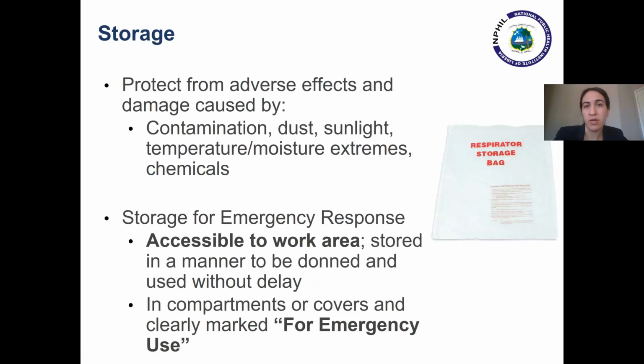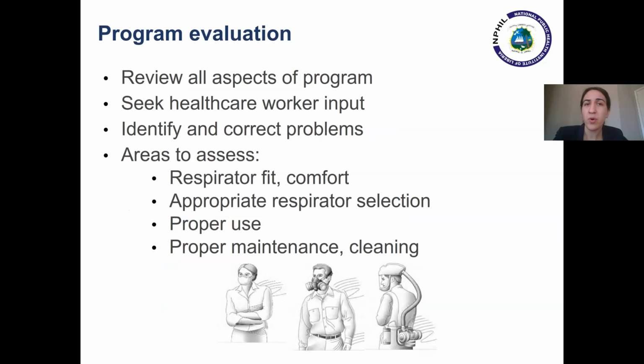Another important component of a respiratory protection program is storage. It's important to protect the respirators from damage caused by contamination, dust, sunlight, chemicals, and temperature extremes. Consider where you want your respirators in an emergency and have them be accessible in the work area. Lastly, it's important to evaluate your program. Input from healthcare workers is extremely valuable here. Some areas to assess include the respirators themselves, as well as how they are being used, cleaned, and maintained.